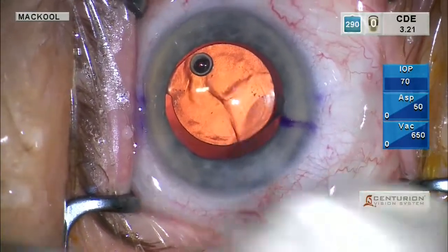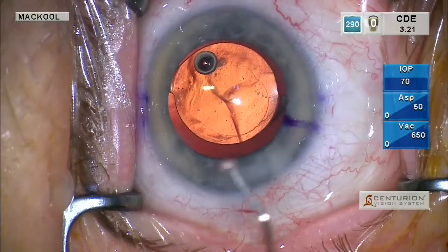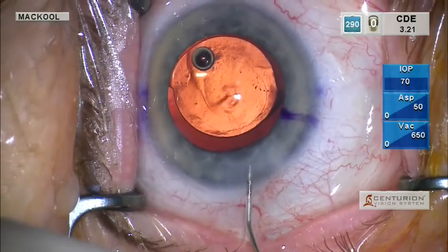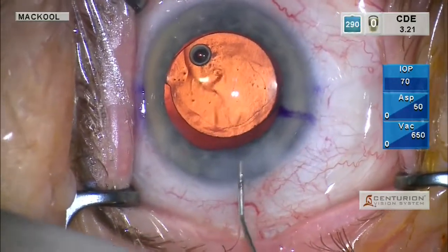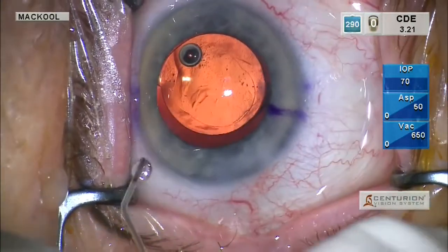Okay, so next will be our myostat injection. And of course, most of the time when you do this, you're going to see the pupil come down. Maybe not to get very myotic, but to lose some of the dilation at least.